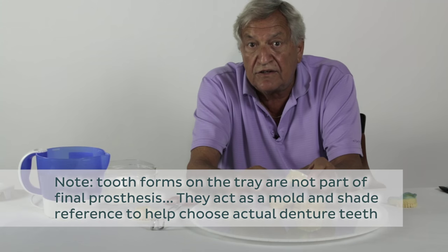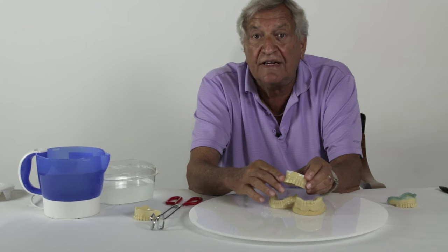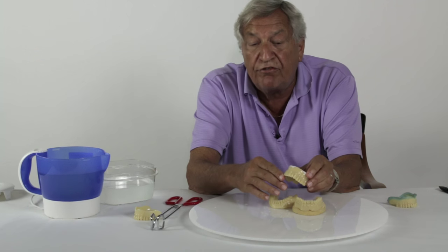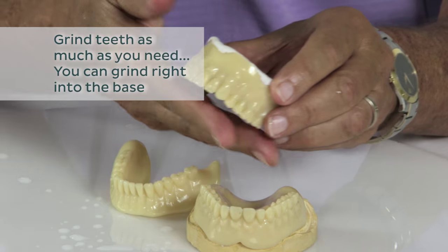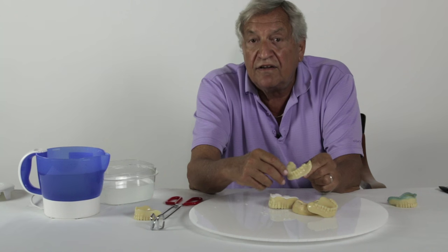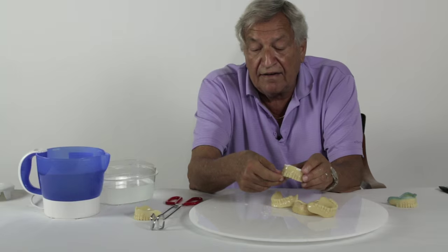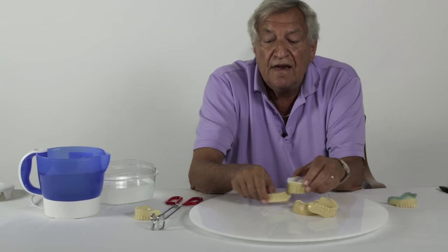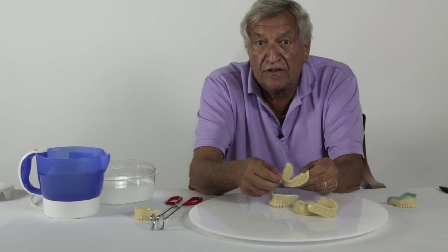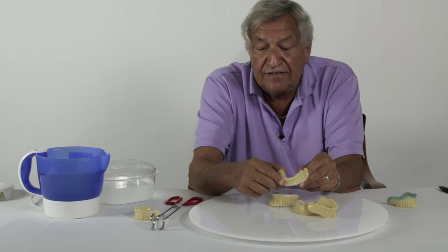He then has to do the final last two steps, which would be vertical and centric. He creates the proper freeway space. If he needs more freeway space, he grinds the occlusal surfaces — we recommend that you grind the lower, because the laboratory is going to use the upper as a setting guide. If he needs less freeway space, he just adds enough wax to establish the vertical dimension. They're excellent for using phonetics and speech to check the vertical, but any technique is acceptable.